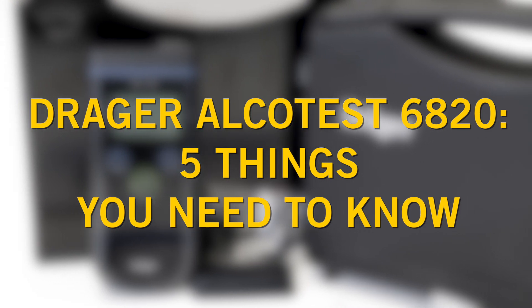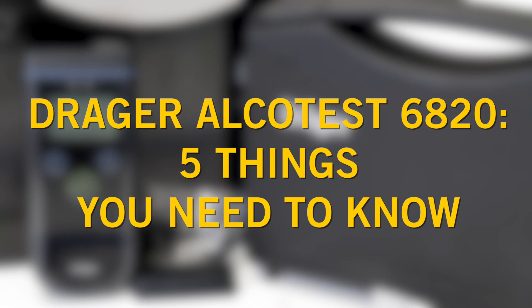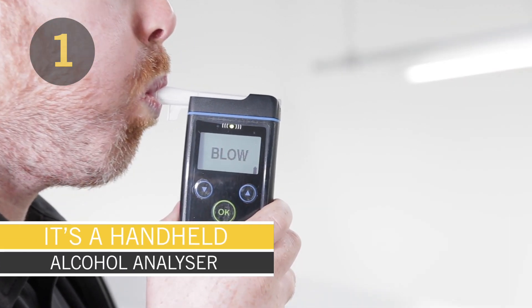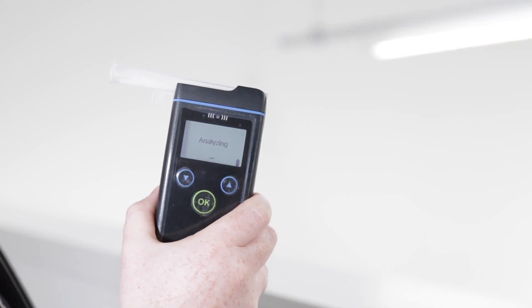Here are five things you need to know about the Draeger Alcotest 6820. It's a handheld alcohol analyser used in professional and industrial applications, capable of monitoring the concentration of alcohol in a person's breath.